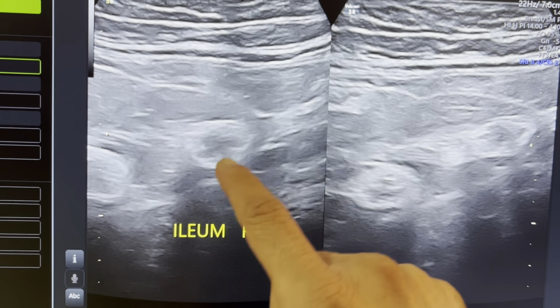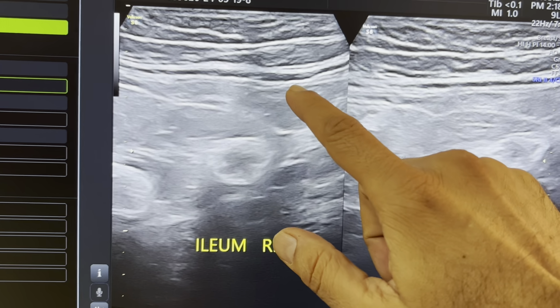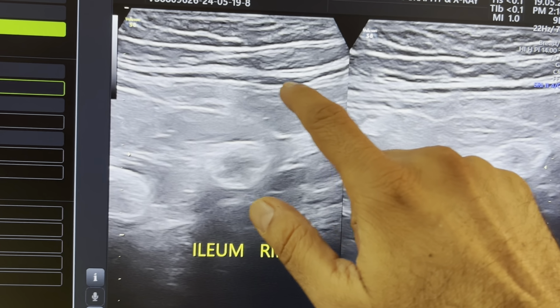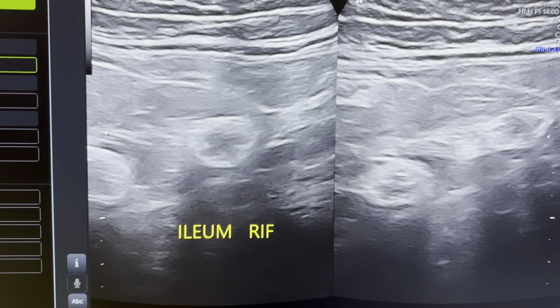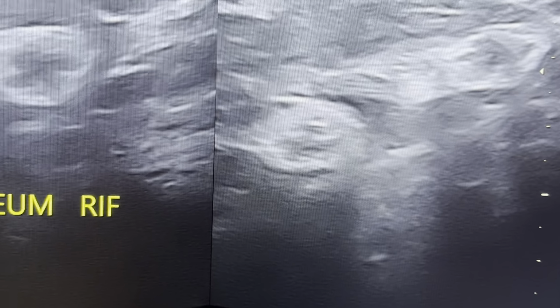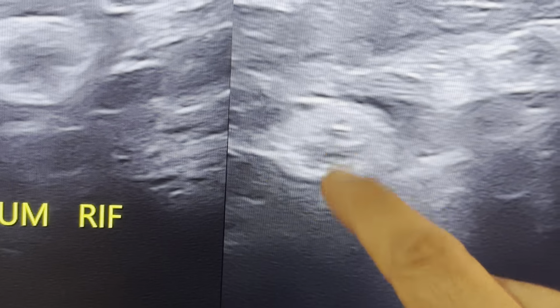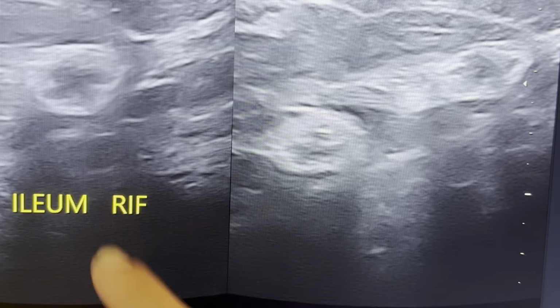These ileal loops are white in color and fibrotic. The basis for saying fibrotic changes is that this muscle sheet, fascia, is whitish in color, and this is also whitish, and the pattern of hyperechoic wall in favor of fibrotic changes is that there is a whitish band inside. In acute ileitis, we see this kind of ileum only, but the main point is that a few loops have this internal fibrotic, hyperechoic line, which is suggestive of fibrotic changes inside the wall of the ileum.